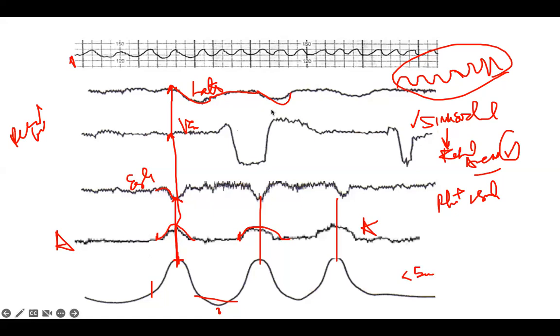Select all that apply can be given to you in different forms, different flavors. I just took a fetal heart tracing and made a question out of it to try to get you guys thinking. And I hope this content is making you more confident, and that may help you pass your exams.